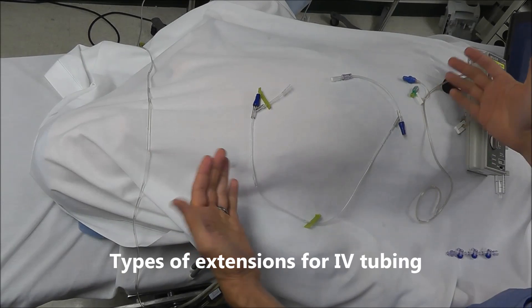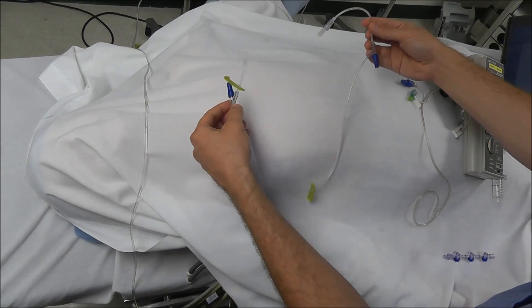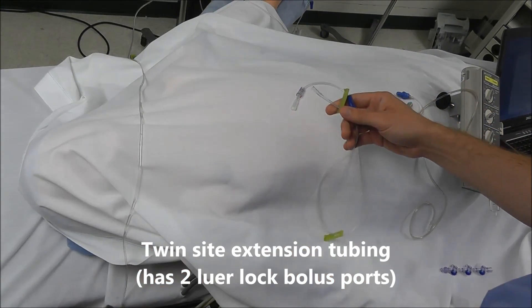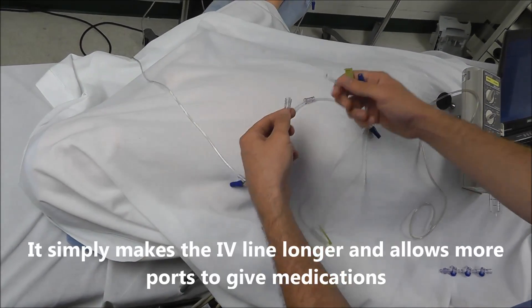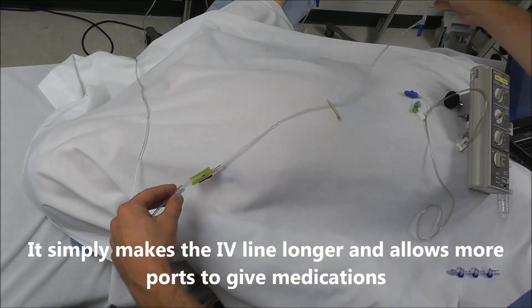Next, we're going to go over the types of extensions available. Extension tubing is really just used to make the length of primary or mini drip tubing longer.